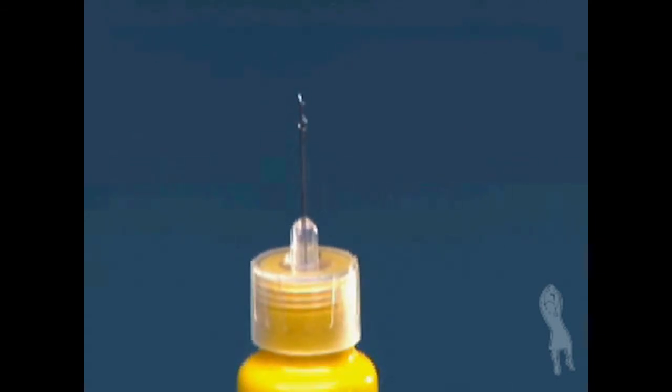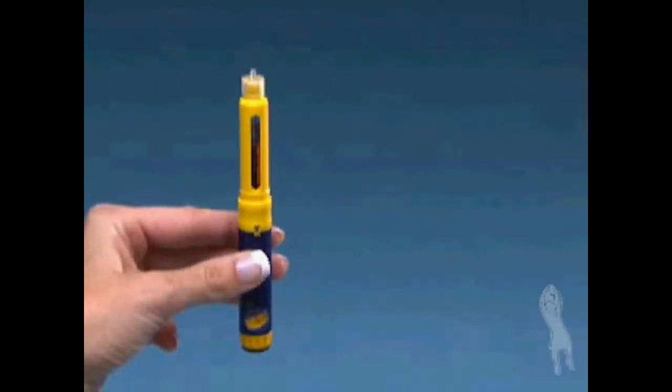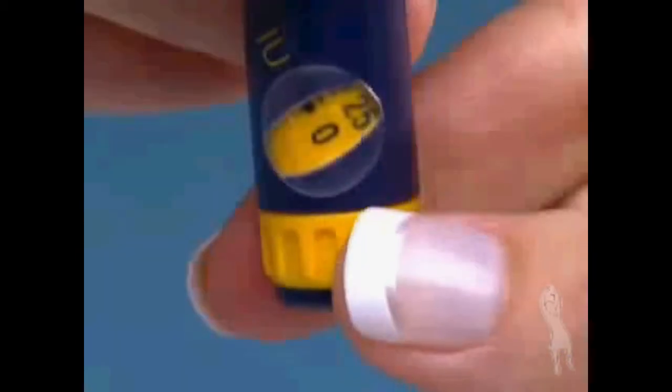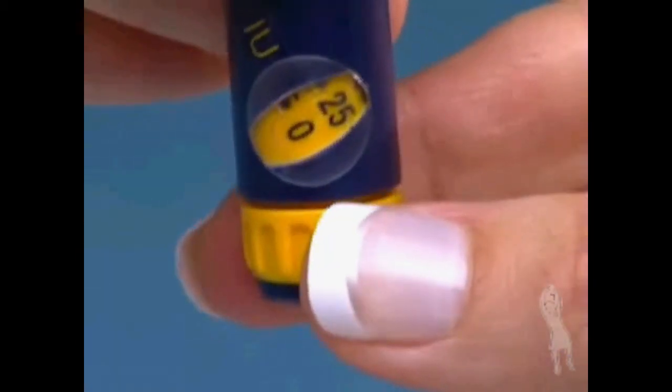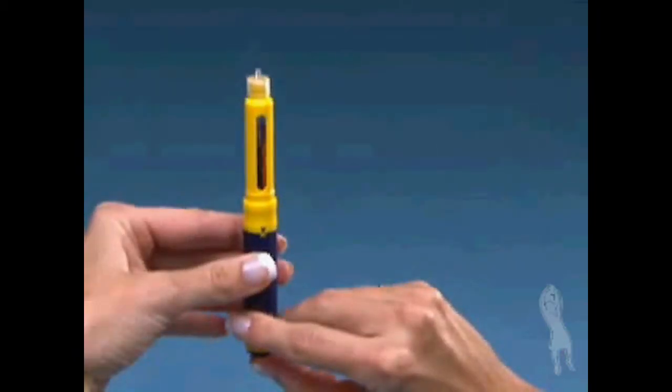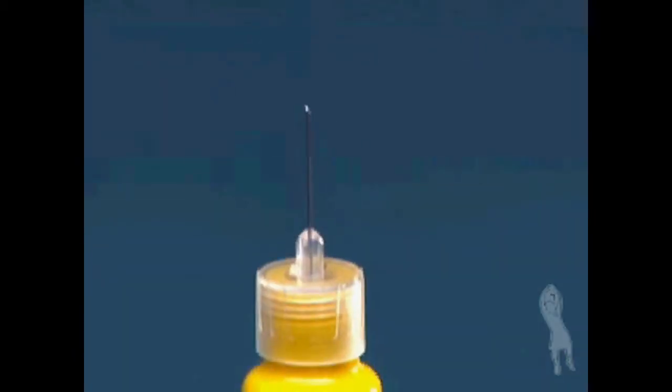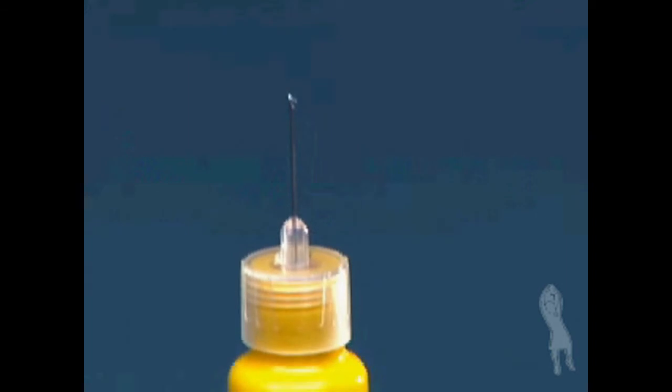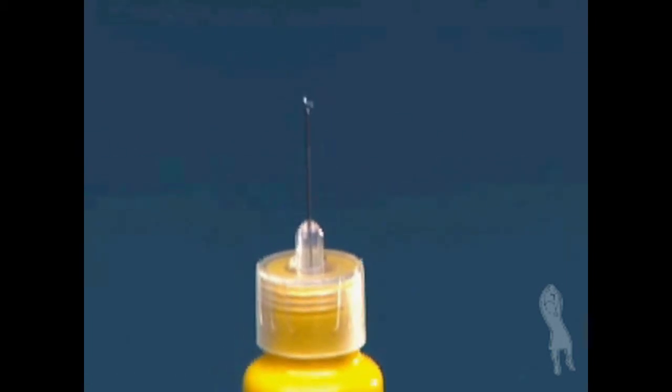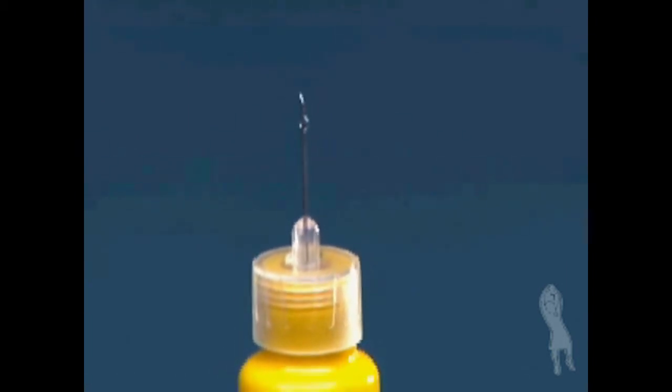If you do not see a droplet, continue with this step. If you did not see a droplet at the tip of the needle, dial the dosage knob until you hear one click. With the needle pointing upwards, push in the injection button. Look for the droplet. If you still did not see a droplet, repeat the previous step until you do. You must make sure you see a droplet or you may not inject the correct amount of medication.